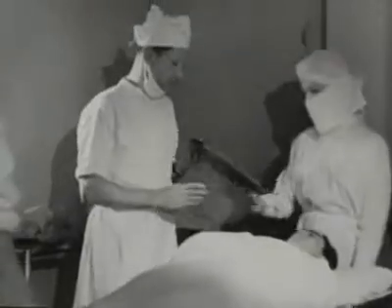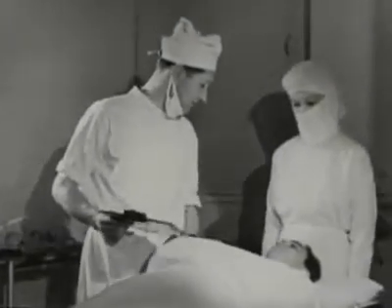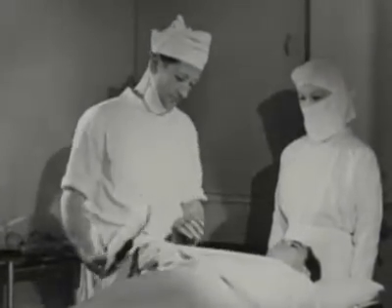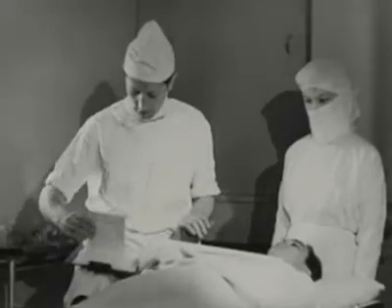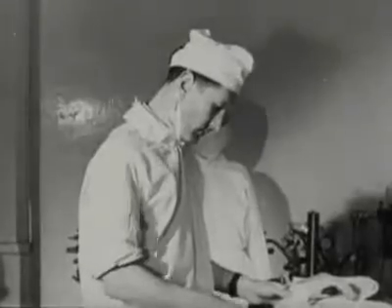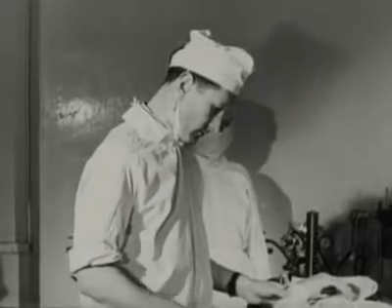You are now ready for the patient. If you feel his pulse before beginning, it'll give you a standard for comparison later. Make sure that he has had the correct premedication and that the record of preoperative examinations is in order.